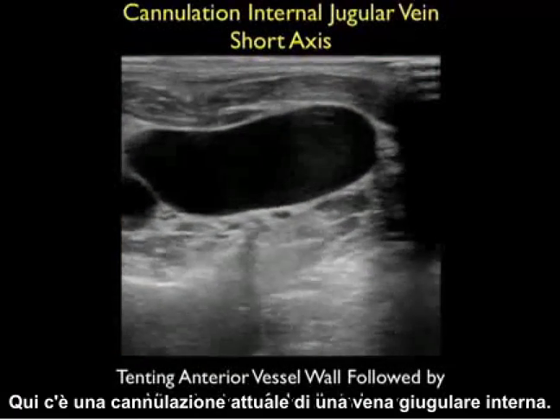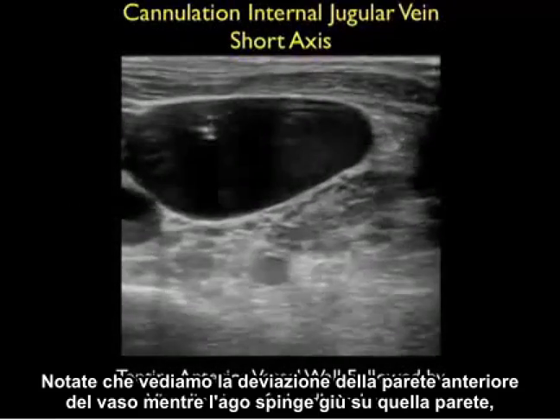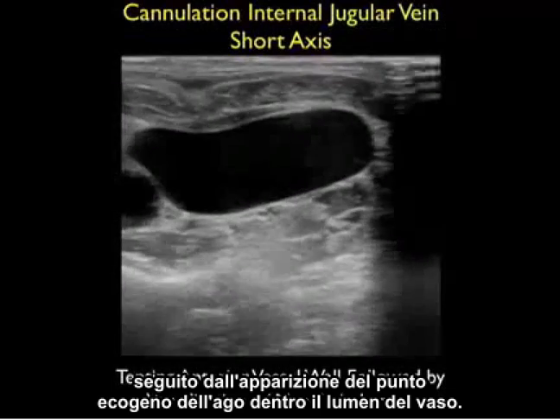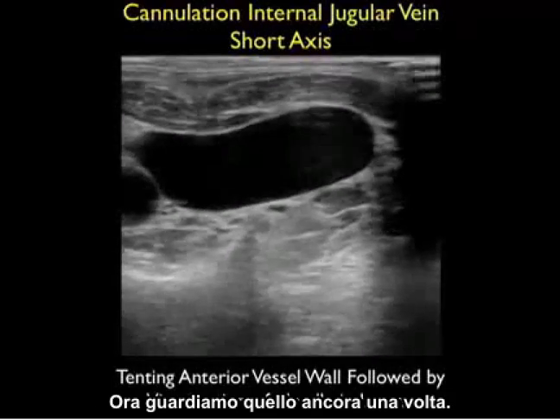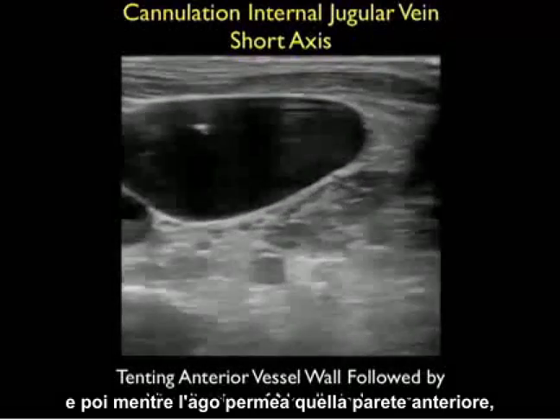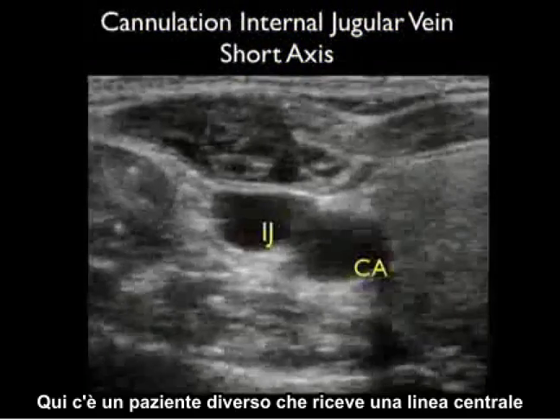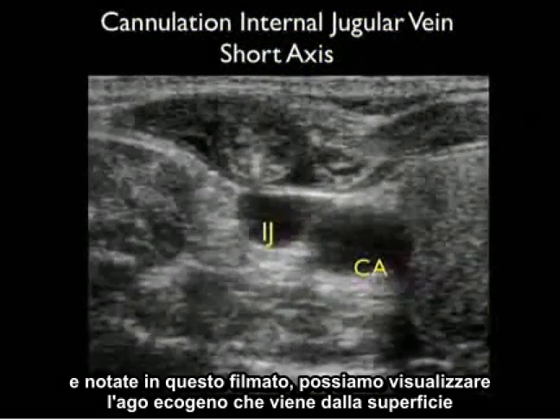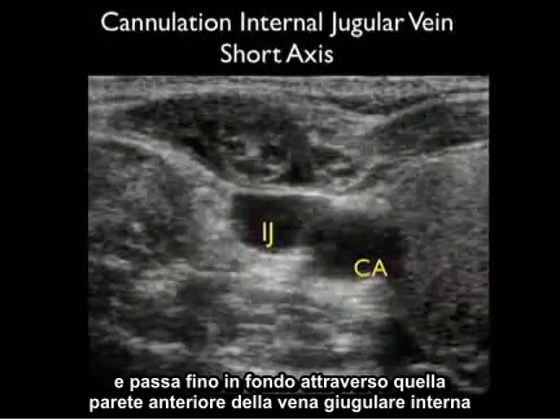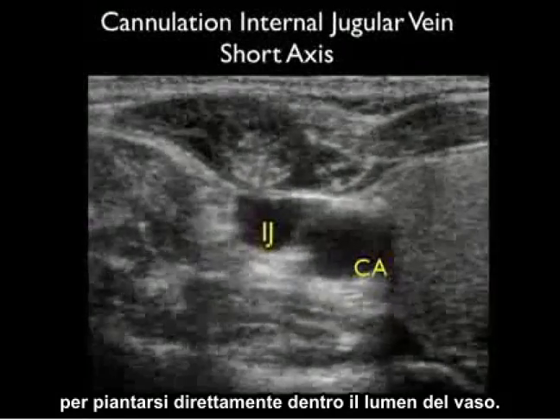Here's an actual cannulation of an internal jugular vein. Notice that we see the deflection of the anterior wall of the vessel as the needle pushes down on that wall, followed by the appearance of the echogenic tip of the needle within the lumen of the vessel. Notice the deflection or pushing down of that anterior wall, and then as the needle permeates that anterior wall we see the appearance of the echogenic tip within the vessel. Here's a different patient receiving a central line — we can actually visualize the echogenic needle coming from the surface and going all the way down through that anterior wall of the internal jugular vein to park directly into the lumen of the vessel.